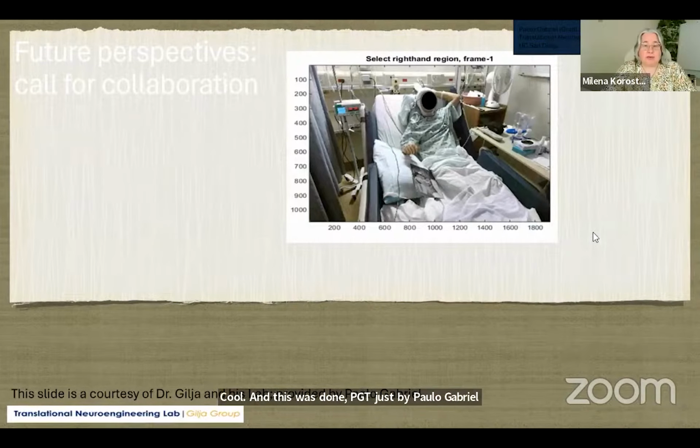And you can see here a patient being evaluated for epilepsy surgery. His seizures are being monitored. And here is the attempt to use current computer vision approaches to monitor the movement of these patients, the movement of this right hand, to map his motor area.